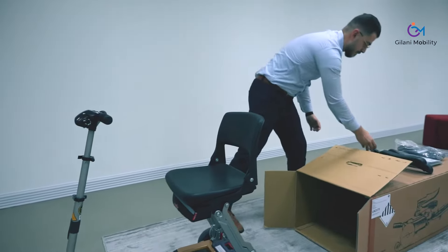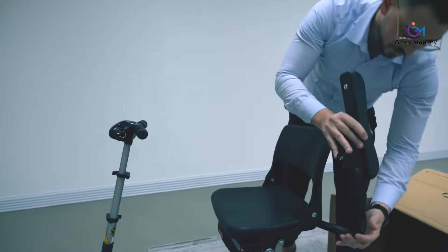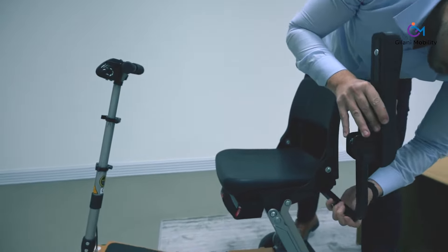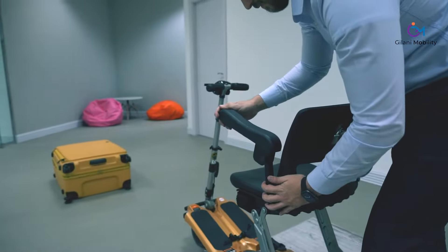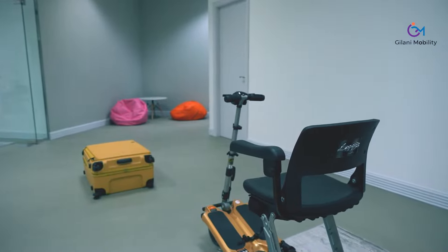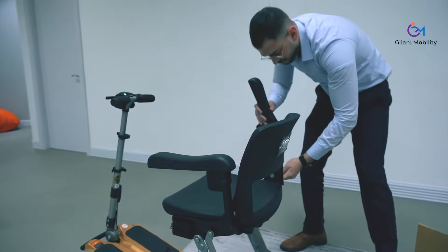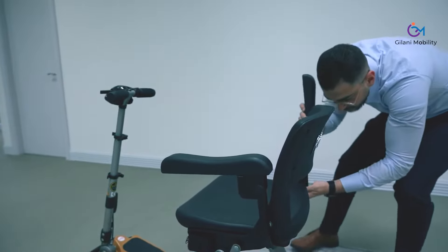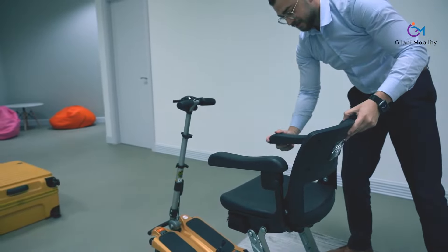The armrests are removable — you don't need to have them if you don't need them at that time. Whenever you want, you can simply slide them in and fold them down, as you can see here. The armrests are adjustable in height and also adjustable in width, so you can decide how much space you want between them. As you slide them in, you can lock them in the right position and angle.